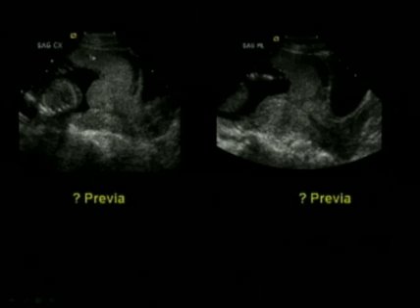So on this case, here's the placenta. This, you'd think, is the cervix, and the placenta covers at least some of it, if not all of it. So you'd think there's a previa. Similarly here, there's the placenta. The internal os, you might think, is right around here, so it's covering it or coming right up to it. Another previa, you would think.